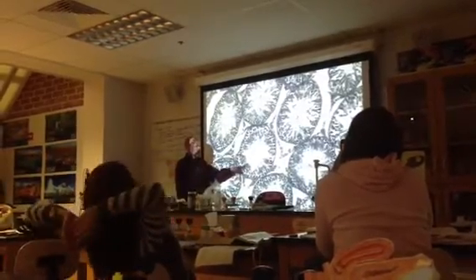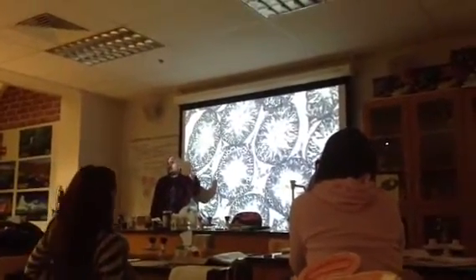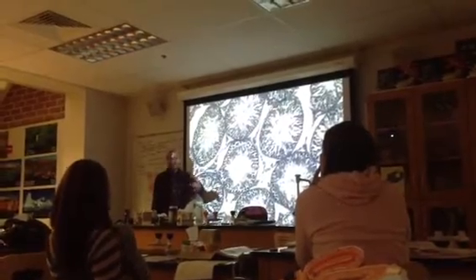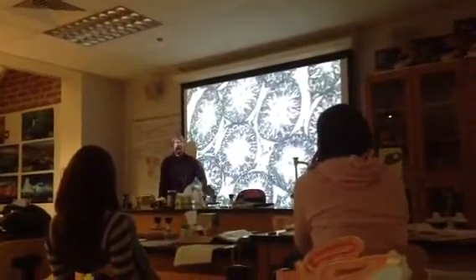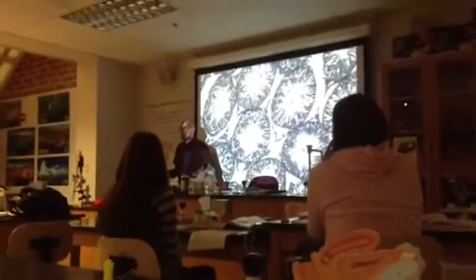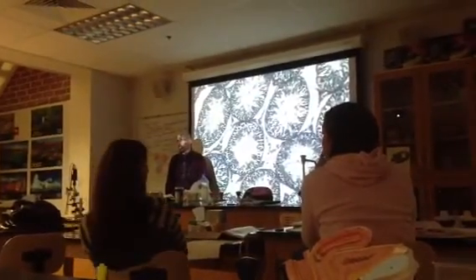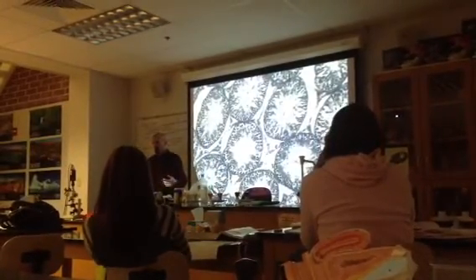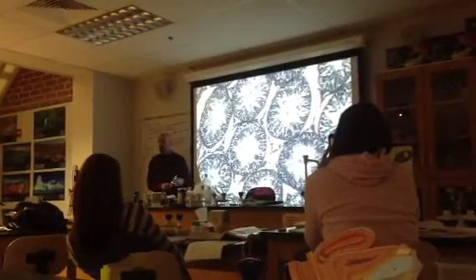There are cells in there we'll be talking about called Sertoli cells that carry these developing sperm towards the center, or the lumen, of the tube, and then release the spermatid into the center. And really the difference between a spermatid and a sperm is that a sperm has grown a tail, and a spermatid does not have a tail yet. So these are actually early stage sperm that have been released into the lumen of the tube. They're not capable of reproduction yet. They have to mature for up to around 2 weeks in the epididymis. They have to learn to swim, essentially.